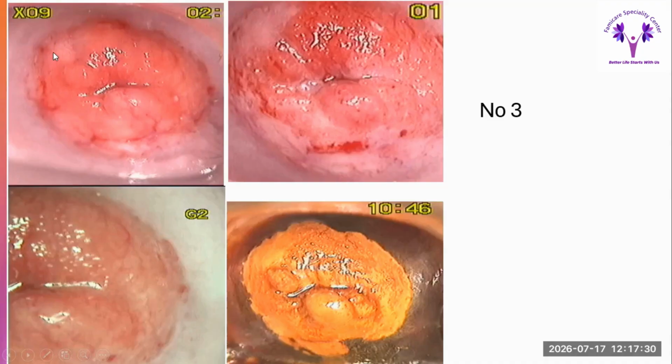Here is the squamous metaplasia. You can see the small tiles being formed. So the metaplastic changes are going on. You can easily see them much more. Here again you see the metaplastic changes going on. And then see again the vessels here, branching type of vessels. So this is absolutely normal. And the color is mahogany brown and yellowish.